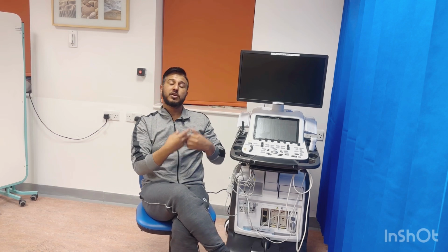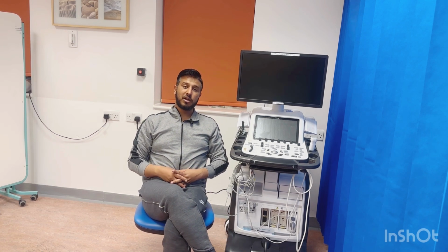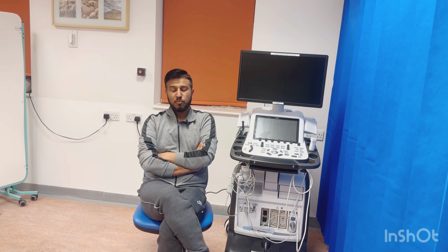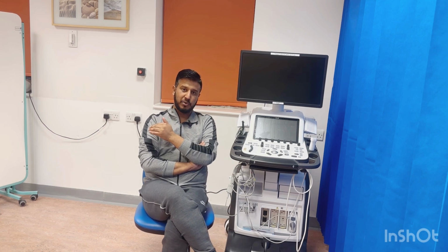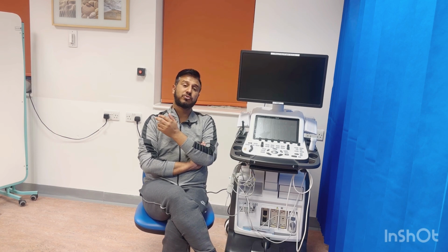starts from there. I would suggest that when we take the normal parasternal long axis view, we usually don't see a very good root and ascending aorta. So most of the time I usually go one space up to measure my aortic root and ascending aorta. I'll show you in images as well, how I used to measure.